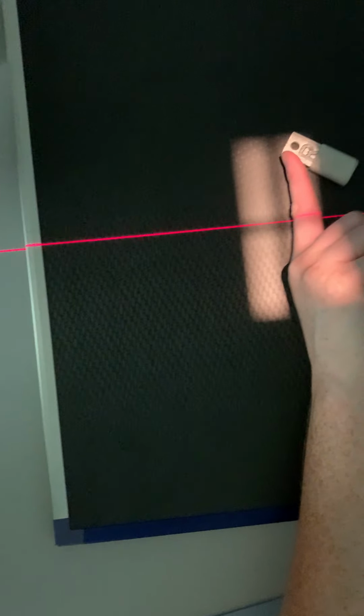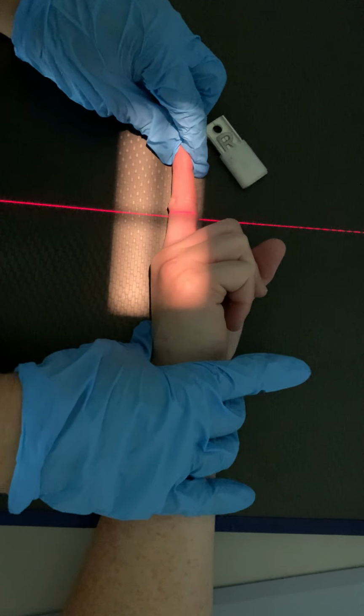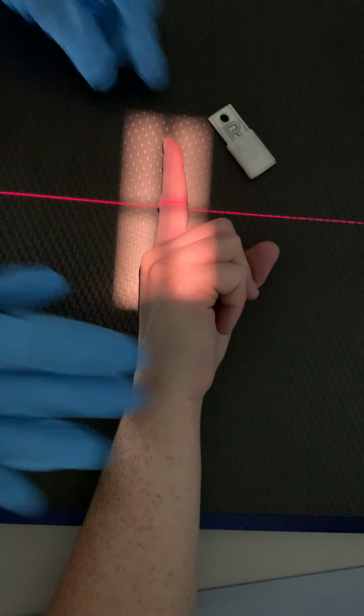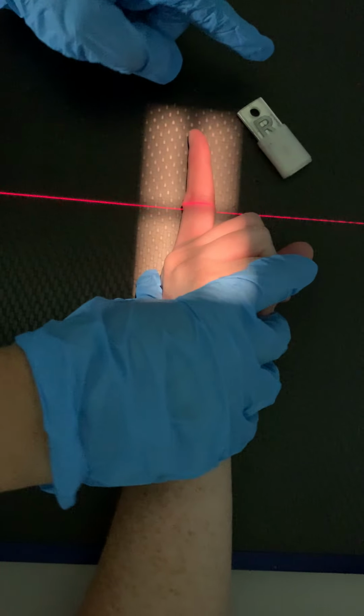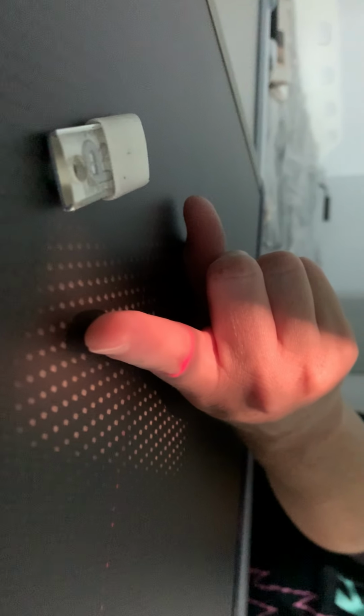And then second digit, super easy, because it's going to be on the IR. Thank you. So we're going to take it here. Watch your fingernail. So see how she is right now? Is she lateral? Just looking at the fingernail. You can tell that fingernail is coming back at an angle right there. So what we need to do is turn until we get that fingernail nice and straight, and she's in a true lateral.